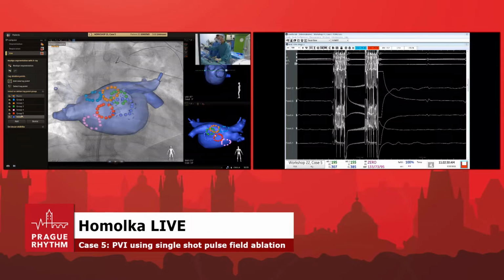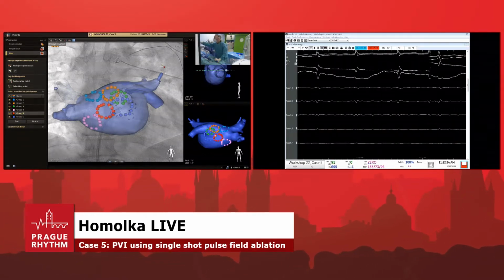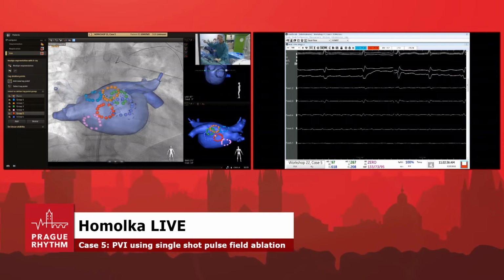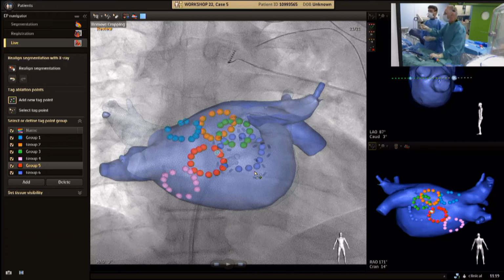Actually, Pepo, let's you explain. We are finished, or nearly finished. But actually, what he marked is not proper. He marked because he is an outside guy. He's very nice, but he did it in a very bad way. So actually, we usually mark the outer splines, because they are the active splines. So we need to really mark differently. So I don't know why he decided to do that. Okay, so our guys are doing better.